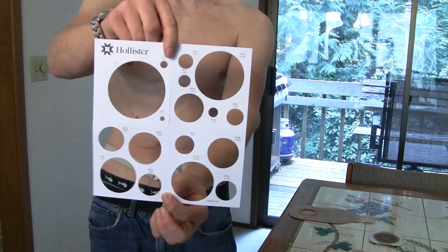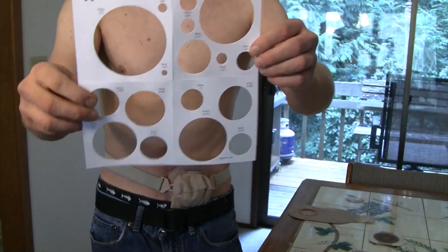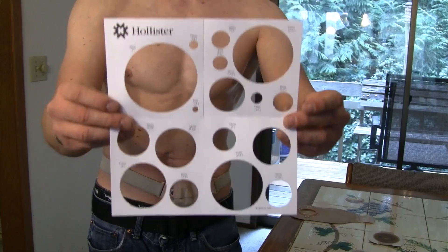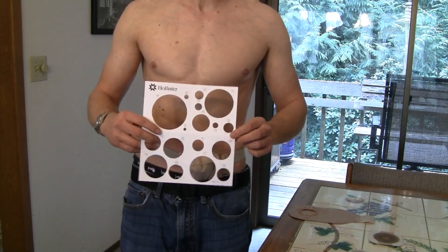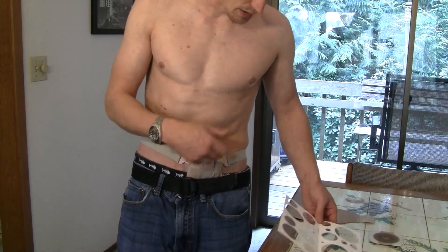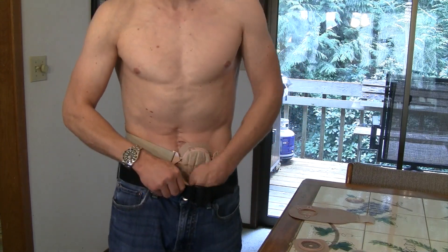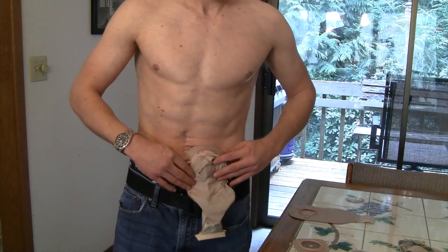What I'm going to do today is go over the Hollister measuring chart — all brands make one. This one comes in the wafer box. I'm going to change my ostomy and show you how I measure my stoma to get the appropriate cut size, so you don't cause damage to the underside.